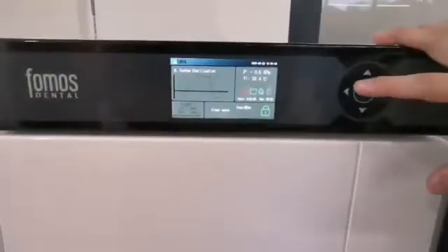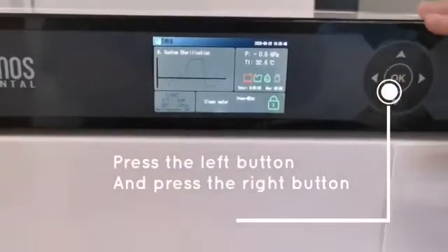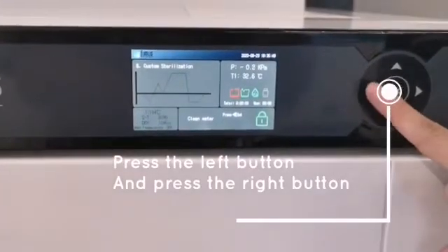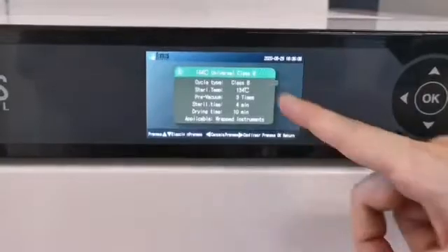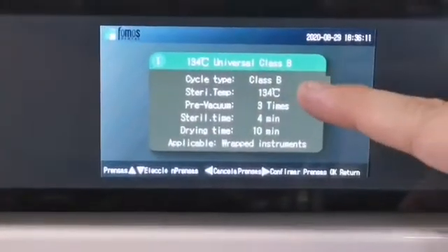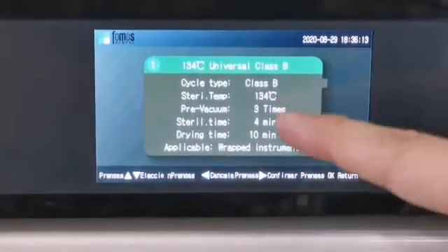We have a cycle program. Press the left button, then press the right button to select the cycle. Number 1: 134 degrees, universal class B — applicable for wrapped instruments.